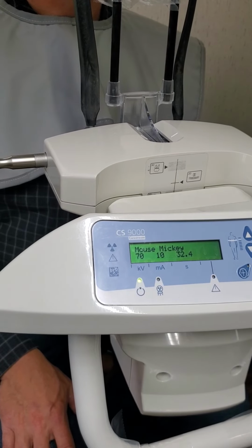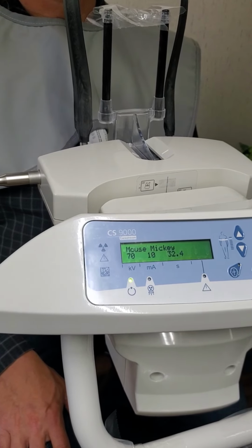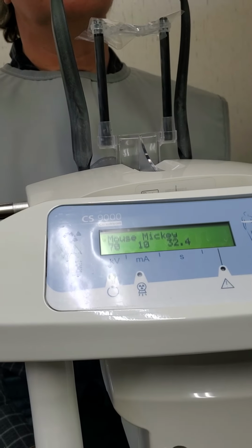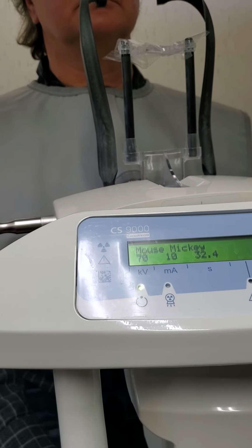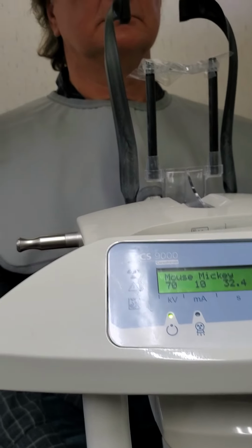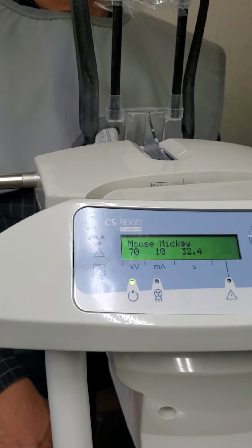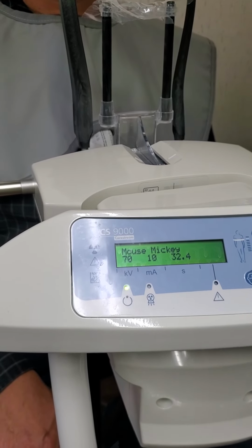If we're doing an upper quadrant tooth or arch, we want to lower this down until there's about 4 or 5 lines showing. Why do you leave lines showing on the top but not the bottom? It's the way that this particular machine behaves. Okay. So if we cover it all the way up, sometimes we end up with cut off crowns and a lot of sinus, which is not always beneficial information for us.